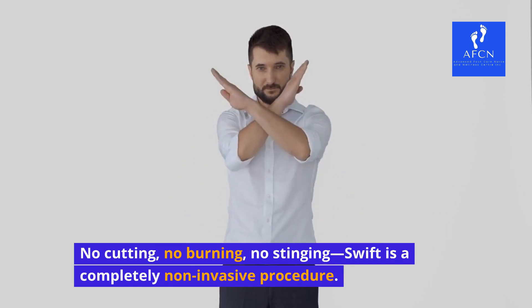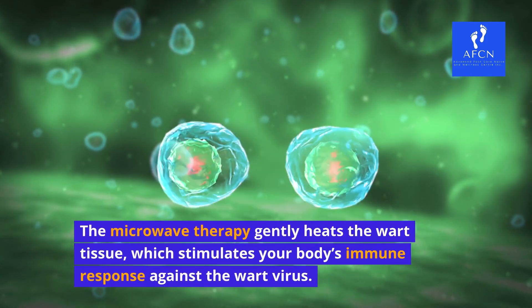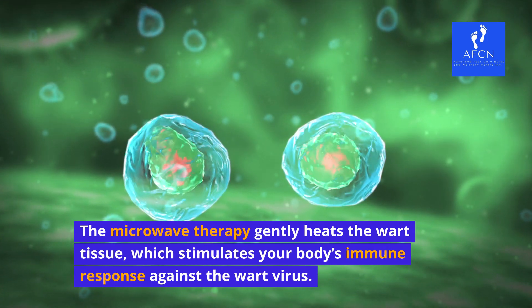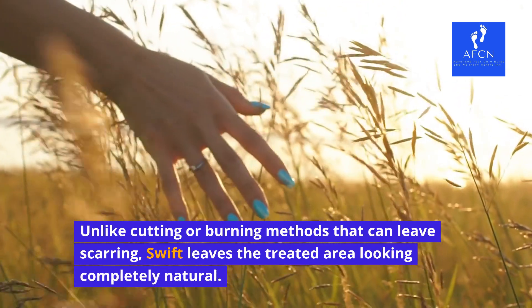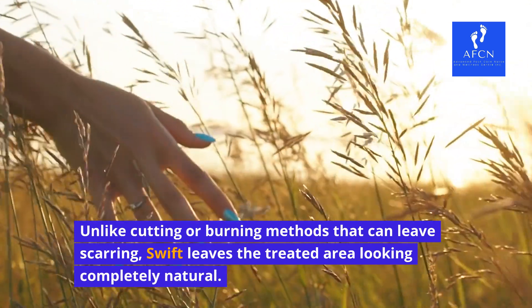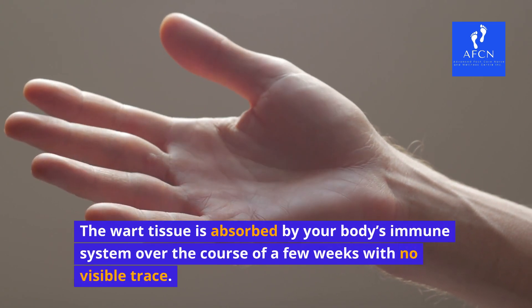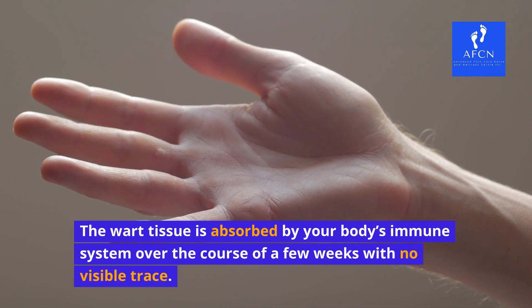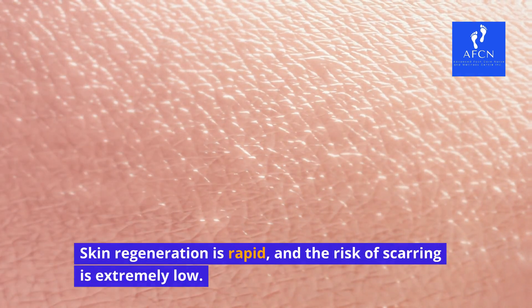Swift is a completely non-invasive procedure. The microwave therapy gently heats the wart tissue, which stimulates your body's immune response against the wart virus. Unlike cutting or burning methods that can leave scarring, Swift leaves the treated area looking completely natural. The wart tissue is absorbed by your body's immune system over the course of a few weeks with no visible trace.